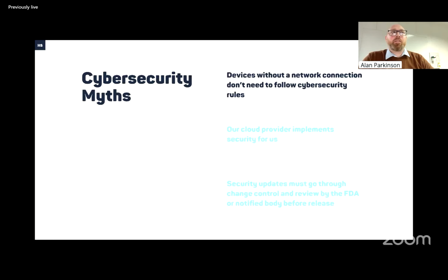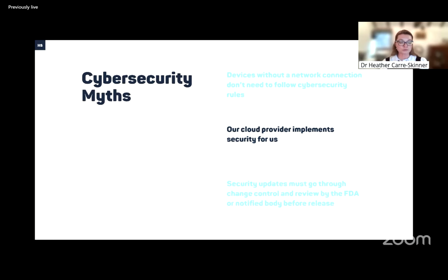secured the device. I would also, sorry, Alan, I would also add to your first point about the FDA, who are really quite hot on cyber, as we all well know, is that even if the device itself isn't currently connected, if it has the potential to be connected, then it still needs to follow those cyber rules. Yes, so true. So Bluetooth as well is another example.